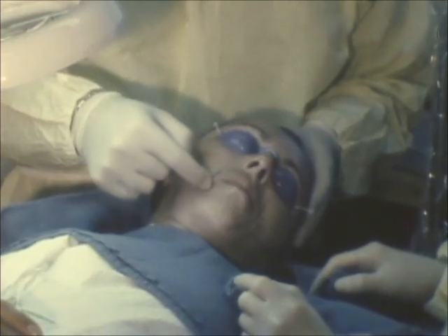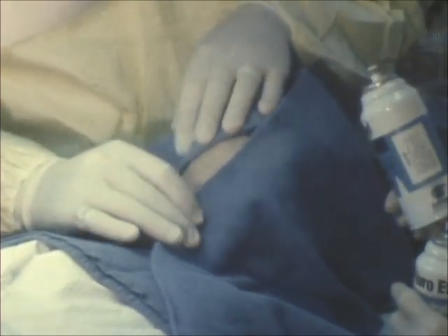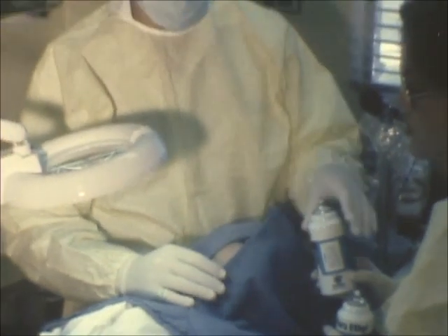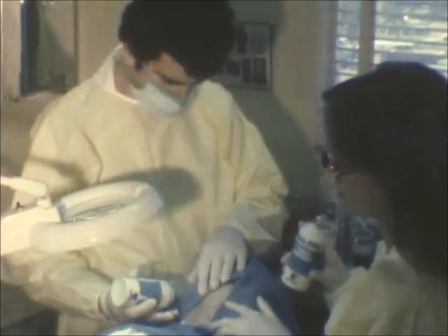In this case, we're going to do the mid-cheek area and down partially to the chin. We'll begin now by covering the face with towels in a triangular fashion. And then we'll freeze the skin with fluoethyl, which is a skin refrigerant, to make it hard. This will allow us to cut into or abrade the skin evenly. We also have to keep the skin quite tight during the procedure.